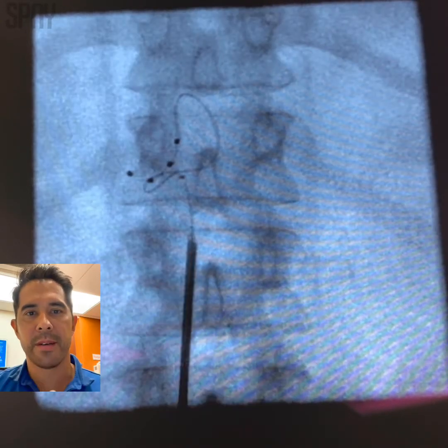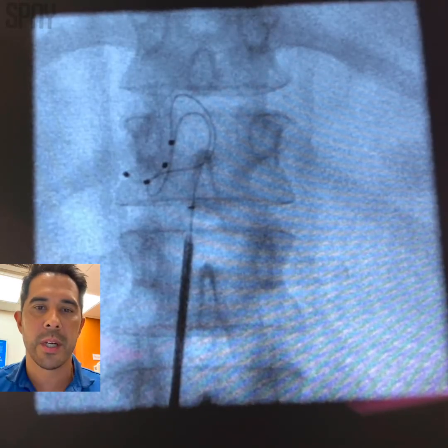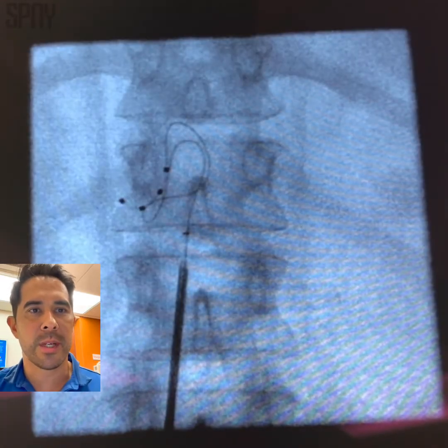Here we have the cord in front. You do not want to turn your introducer sheath towards the spinal cord — you can cause neurological insult there. And look, we got double loops there.